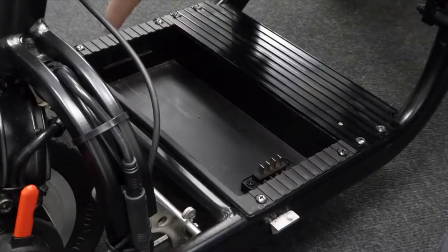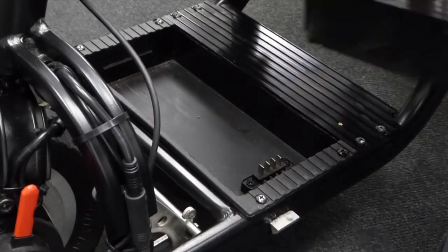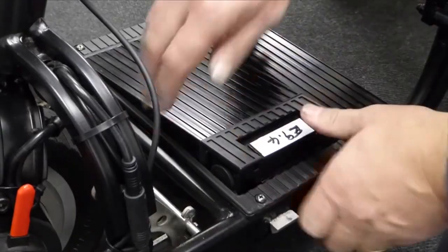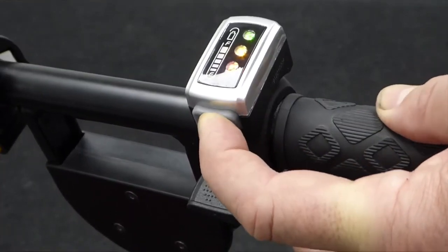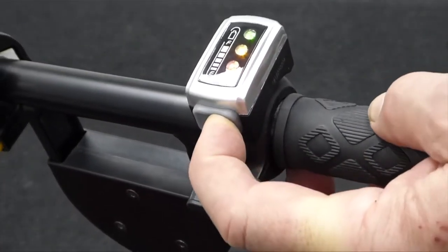Make sure the battery compartment is free of liquids and obstructions, then slide and press the battery into place. Press the start button to power the scooter and use the thumb paddle throttle to drive. Braking will be applied automatically when you release the throttle.